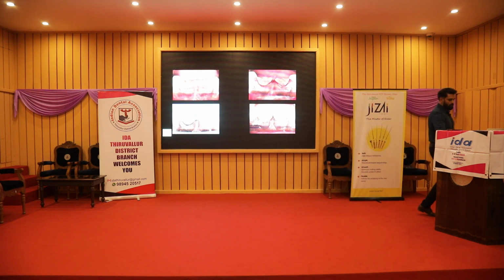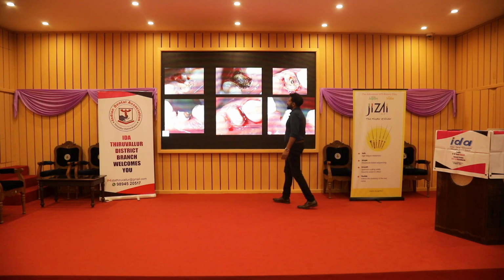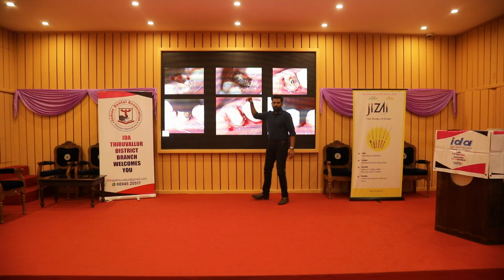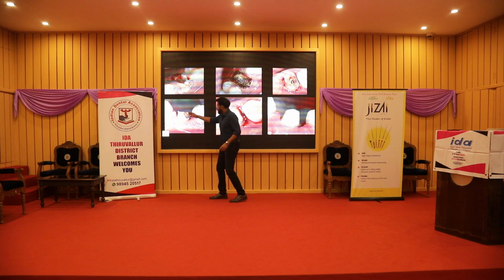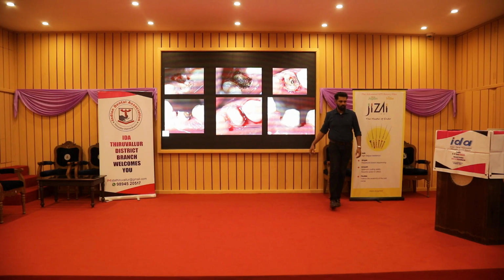This is another case of mine where the ferrule was very less, circumferential ferrule was not there. Again, gingivectomy was done using laser, and this is the ferrule structure which is available. Again, it was not done using rubber dam. This is a ferrule, and then the post was placed, and finally the core structure was built.